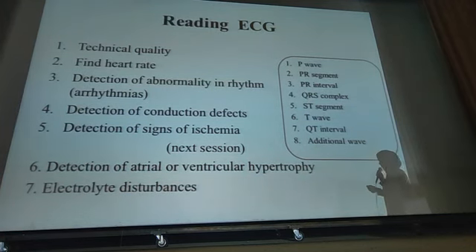That's why it's better first to see the technical quality and then find the heart rate. Then detect any abnormality in rhythm, which is called arrhythmia.